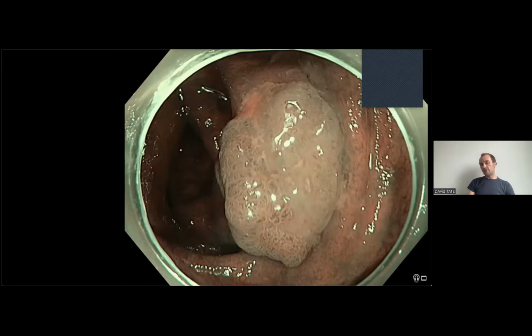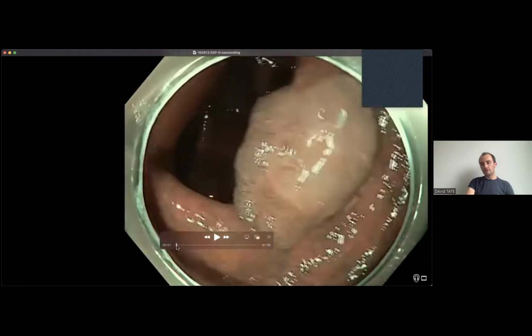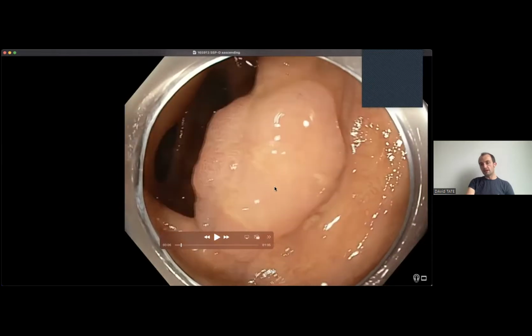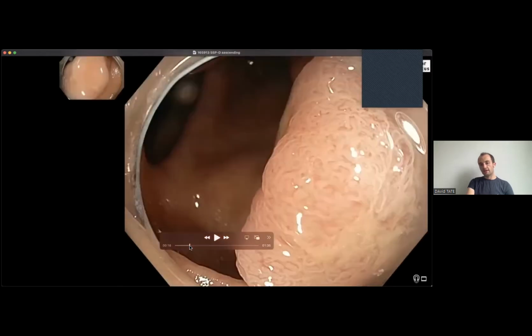How do you classify a serrated polyp? Well, they look like this. This thing on the right, so they tend to have mucus attached to them, and you see that this one did when we started. You see it there. This NBI is not useful, but when you see it in white light, there's a bit of mucus attached to it. They tend to have difficult margins to determine. So the colleague who was speaking before was saying about difficult margins, where you can see that the margins of this side, the left side, are very easy to determine, but the margins of the right side are maybe more difficult, right? It's not very clear where this ends and where the normal bowel wall starts, whereas the bit on the left is very clear.